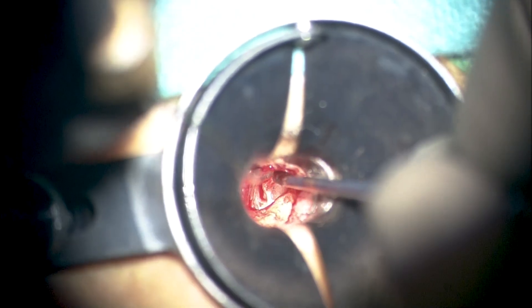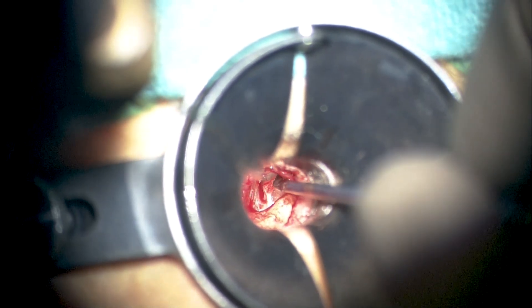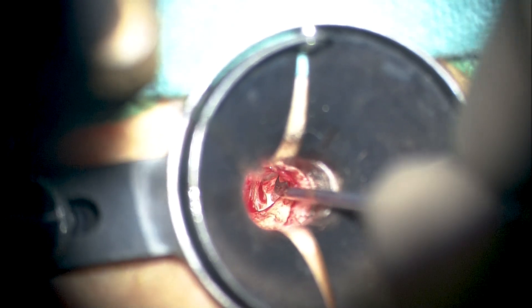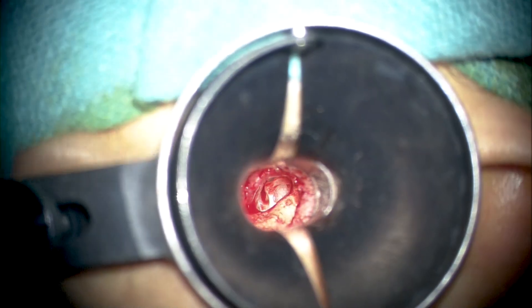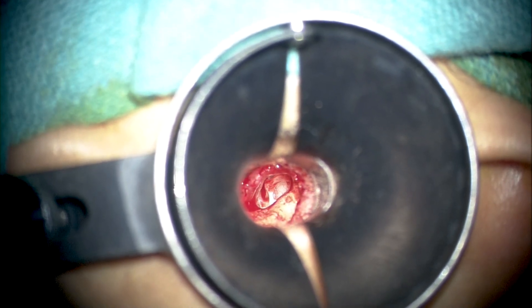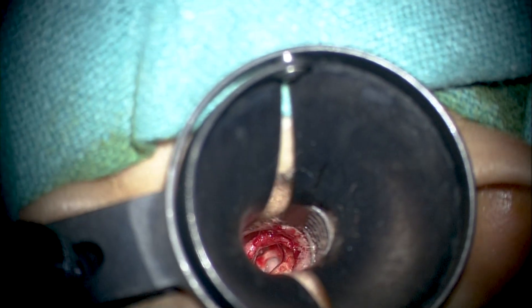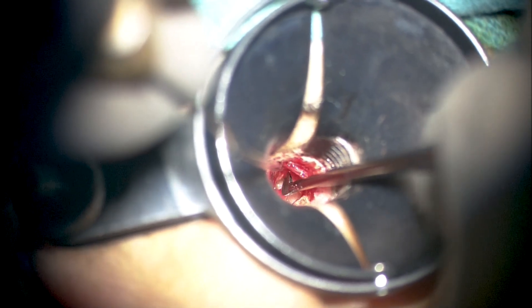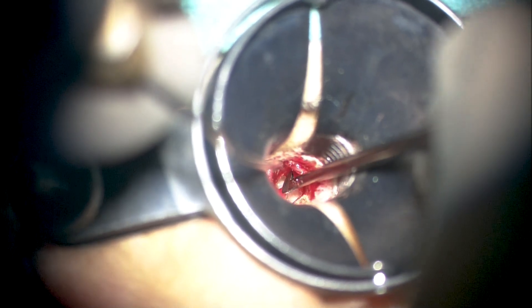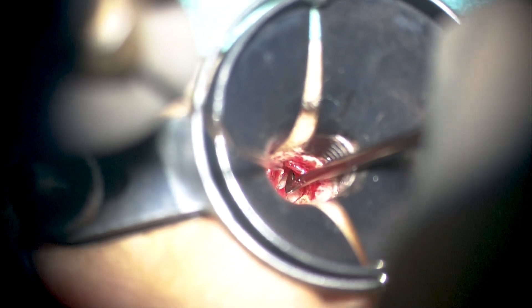At any point when we feel the superior traction is too much, we can release the flap inferiorly a little more to keep pushing anteriorly. The most frequent cause of flap tears here is creating a small or tunnel-type flap arrangement, where eventually the pressure becomes too much for the flap to be lifted, and the tense skin — which is already very frail in the posterior superior pars tensa — automatically tears.